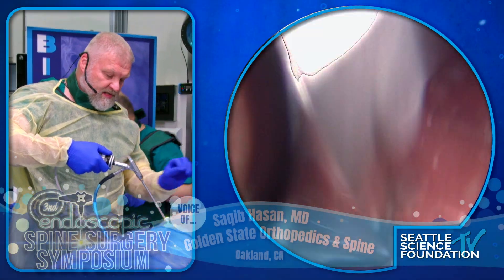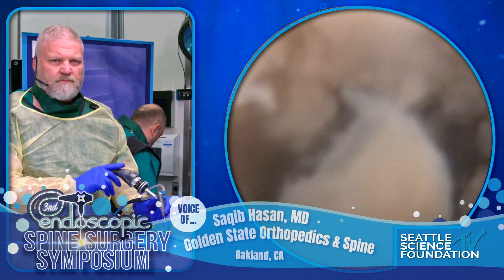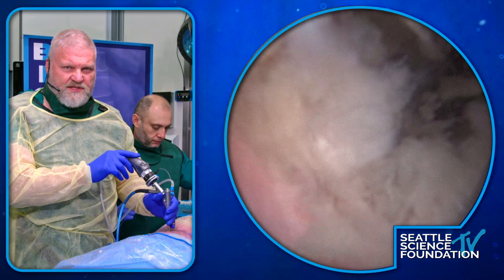Step one is we'll put some fluid on and figure out where we are. Looks like there's the cage.